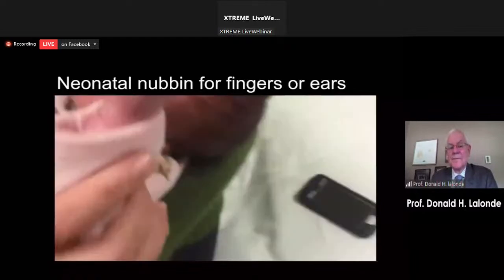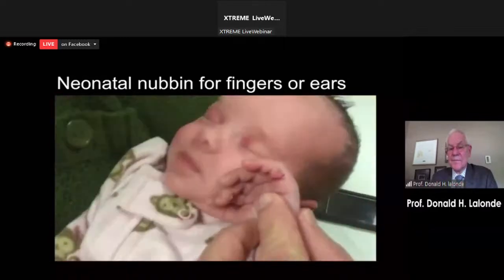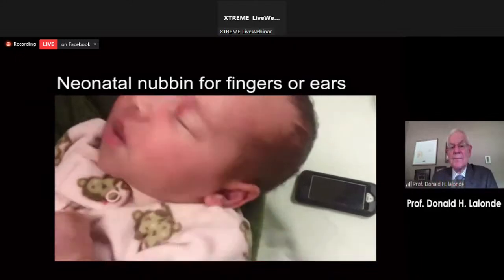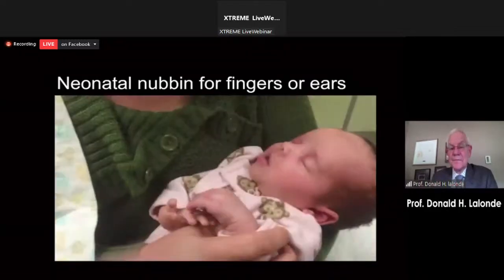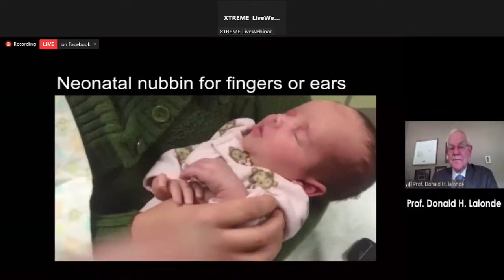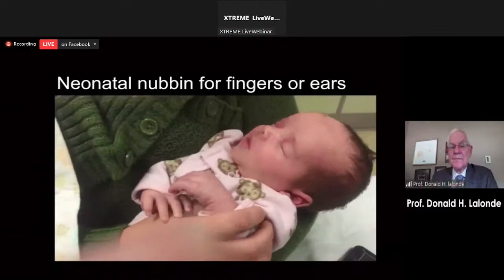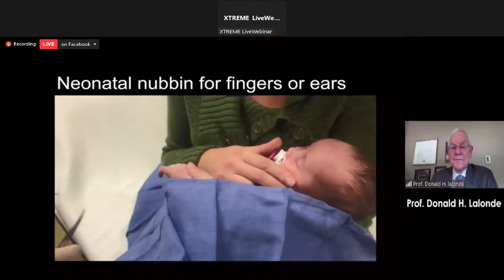She's almost sleeping. But freezing in right there, we put in about half a cc of 1% lidocaine with 1 in 100,000 epinephrine in the little finger nubbin and let it work. And now the baby's finished eating. Clearly, she is having the best general anesthesia in the world. If I can do this without stimulating the baby, then the baby will not move.